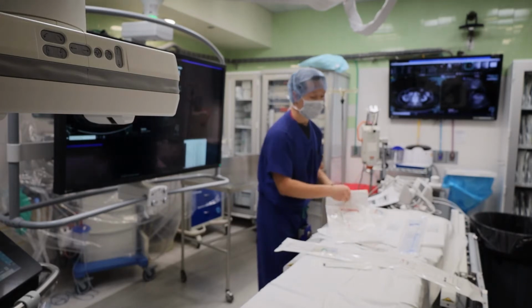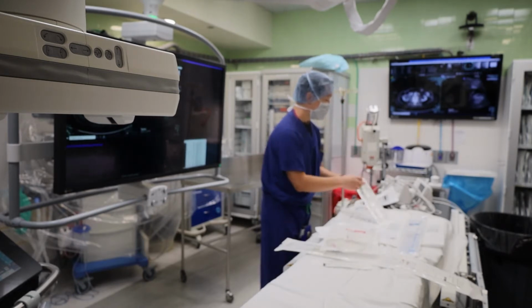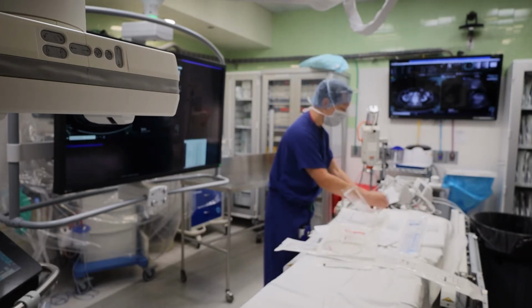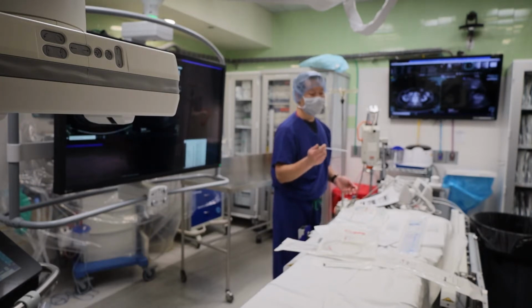Another reason why we use it is because, do you guys know the gauge of this needle? 21 gauge needle, right? Not uncommon to have to stick the kidney multiple times, right? The kidney, as we said, is a highly vascularized organ. Nobody cares about a venous bleed, I mean people do, but the worst thing you want to do is to hit an artery, right? Then now you've got a septic shock person that you've got to stick a tube in and flip them and then do an embo, right? Not something you want to do. That's the reason why we don't stick things with an 18 gauge, okay? You can stick this multiple times.